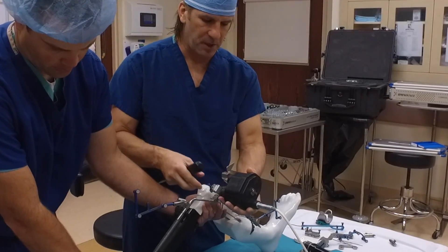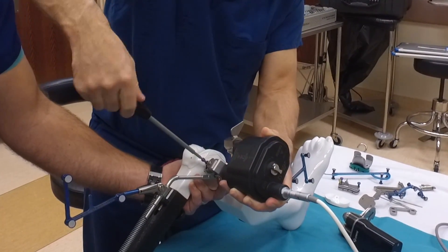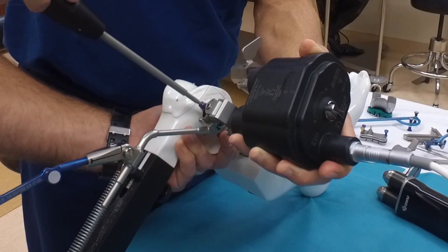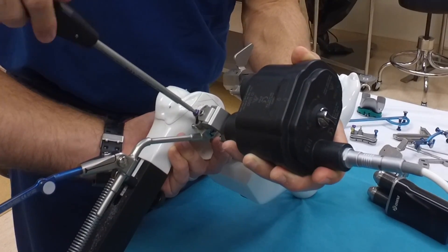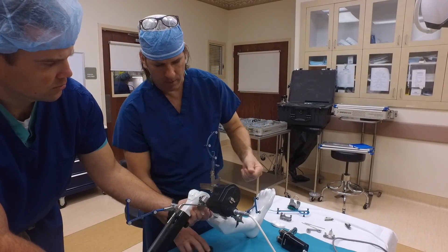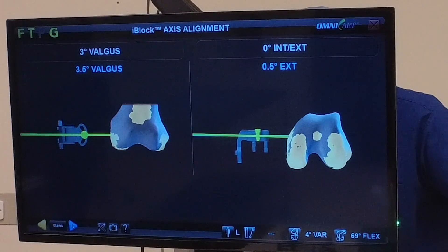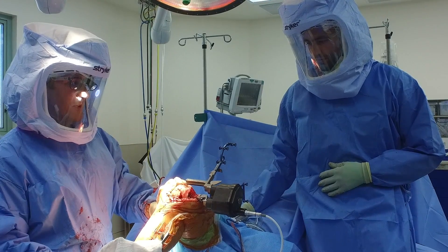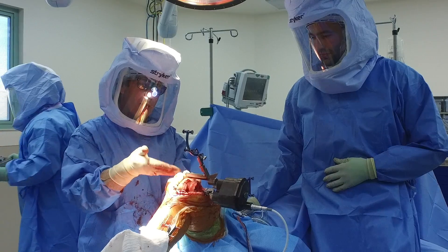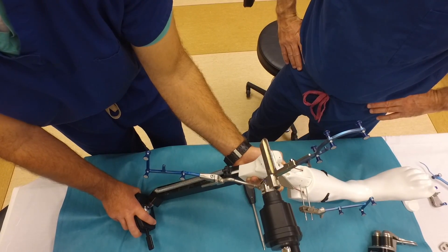Now this is the real robotic portion. We put this into the femoral trackers that we've already calibrated — they're fixed to the patient's bone. We secure this down. This is going to put our guides exactly where we want them. We calibrate this machine, make sure it's communicating with the computer, dial it in, and then we're ready to go. It is going to move and put the cutting guides right where we need them to be. The robot takes over to make sure it has adequate space to get to all the cuts we've pre-planned. You can see it moves the saw capture to make the front cut then the distal cut, sawing within that saw capture exactly as we pre-planned.